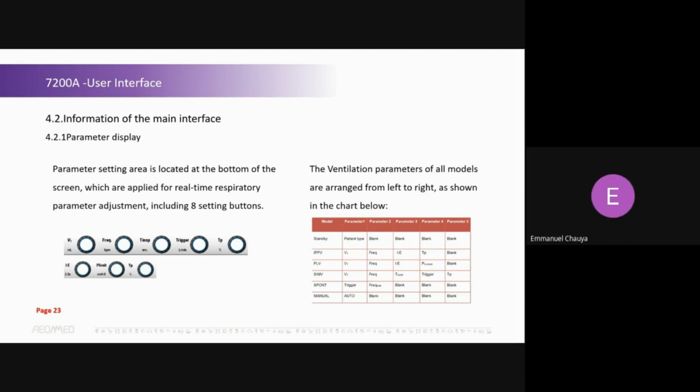And we have another question in the chat. This is from Chimwemwe TS, and he asks, in cases where there is no external oxygen source, does the unit, in this case the machine, have the option to use room air as a carrier gas?